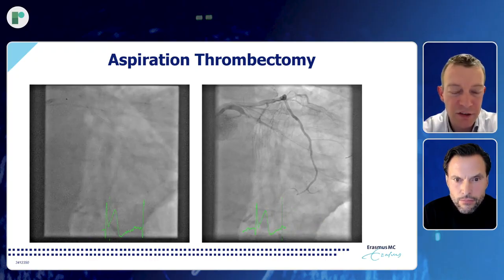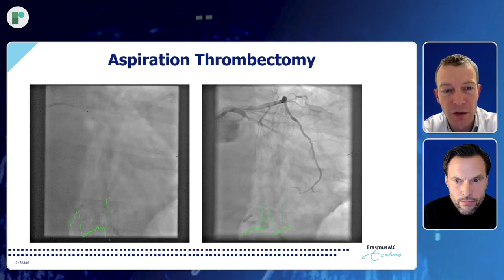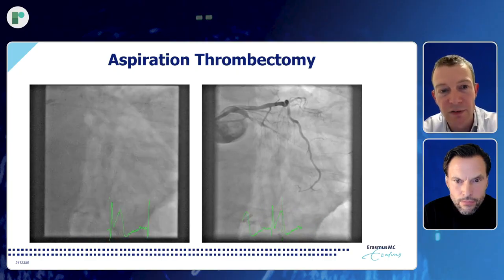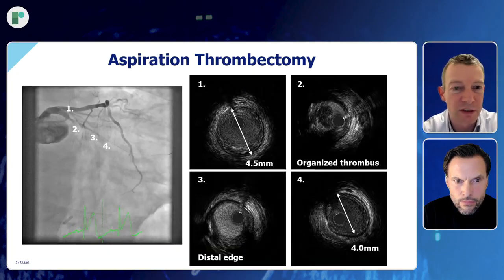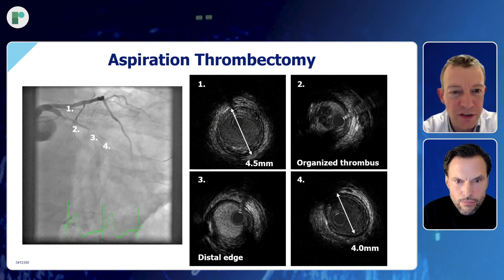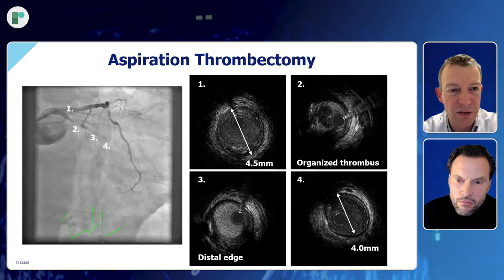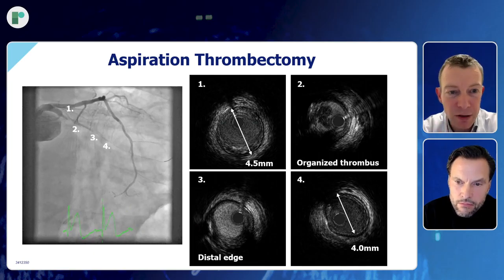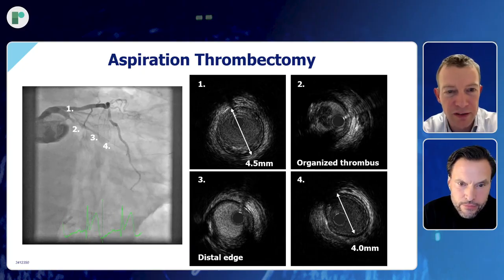And this is a case that we actually enrolled in the Spectrum trial that we did with the support of Assist Medical in order to find the value of high definition IVUS guided PCI in patients presenting with STEMI. And if I show you this pullback, this is likely not what you anticipated. So if you look at image 4 on the right bottom of the screen, this circumflex is actually a 4.0 vessel in which no disease is present in the distal trajectory. In the mid part, distal edge, you see plaque, you see a plaque volume of about 50%.